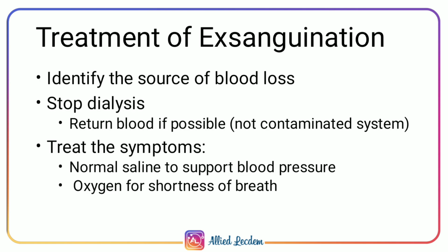And the treatment of exsanguination: identify the source of blood loss, stop dialysis, return blood if possible, treat the symptoms, give normal saline to support blood pressure, and oxygen for shortness of breath.